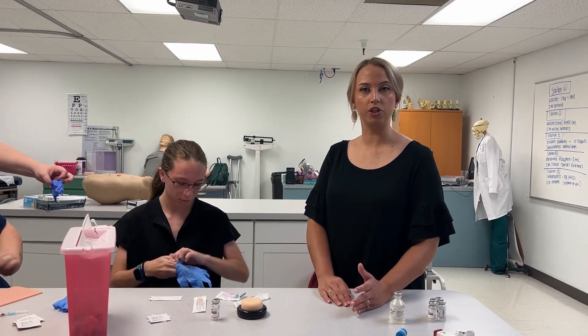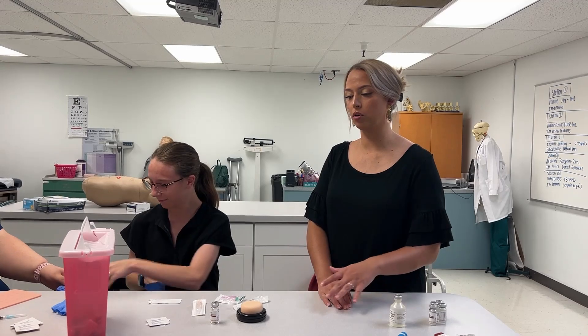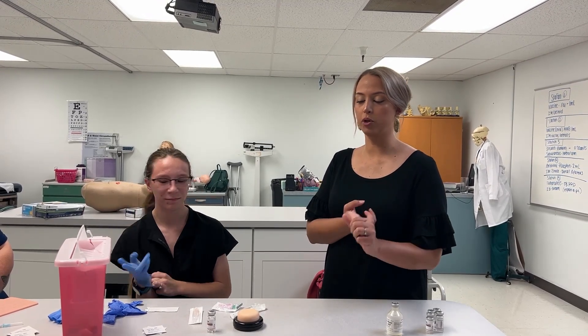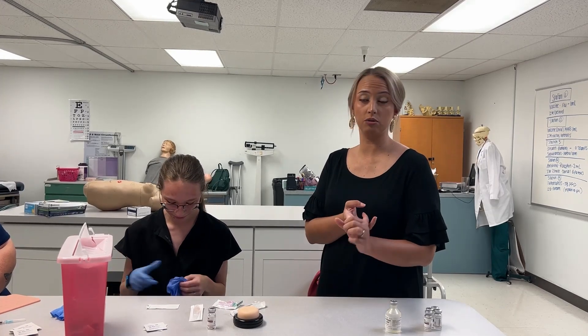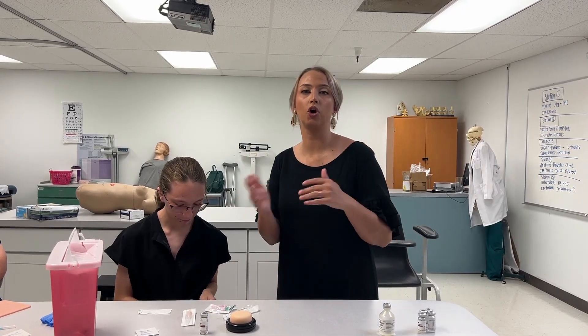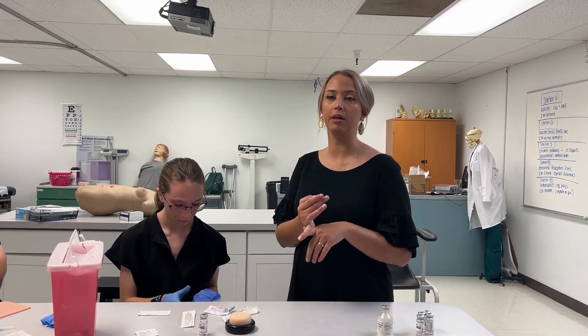We're going to verify that we have the correct medication. We're going to verify three separate times: when we look at the order, we're going to make sure it's the correct medication and dose; before we draw it up out of the syringe, we're going to make sure it's the correct medication and dose; and before we administer it. After I give it to the patient and chart it, I always make sure it's the correct medication and dose.